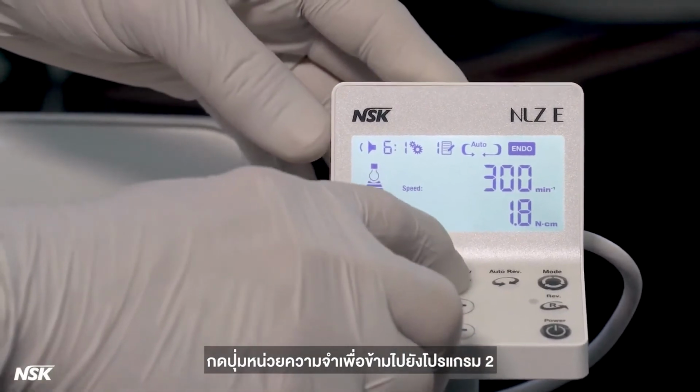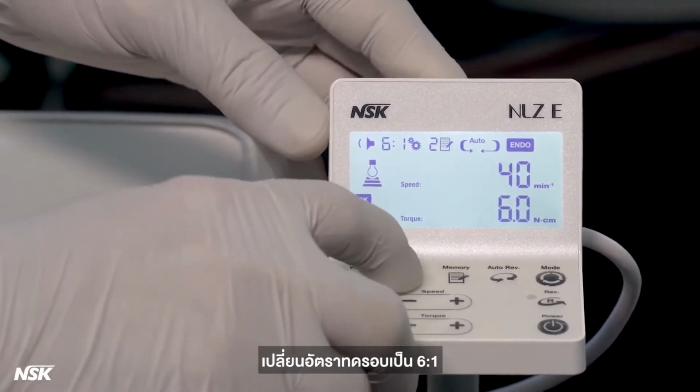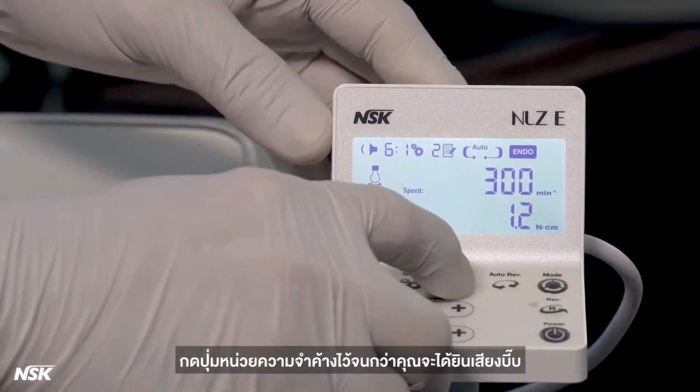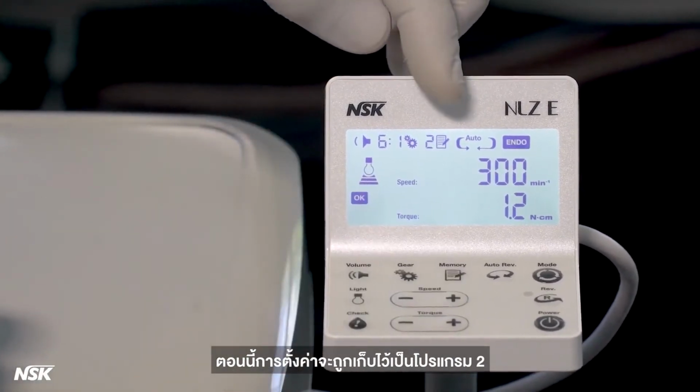Press the memory button to jump to program number 2. Change the gear ratio to 6-to-1. Dial the speed to 300 RPM. Dial the torque to 1.2 Newton centimeters. Press and hold the memory button until you hear a beep. Now the setting is stored as program number 2.